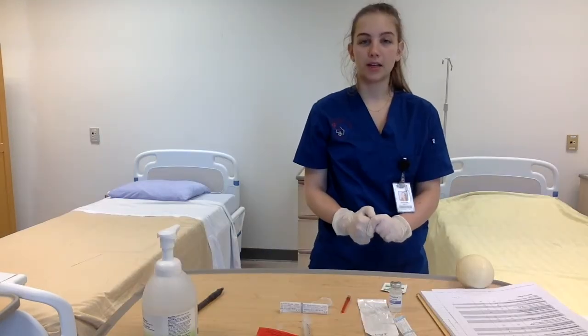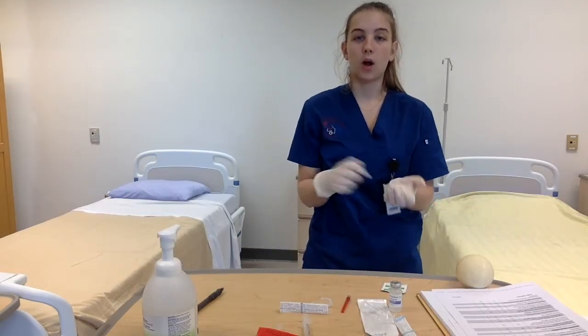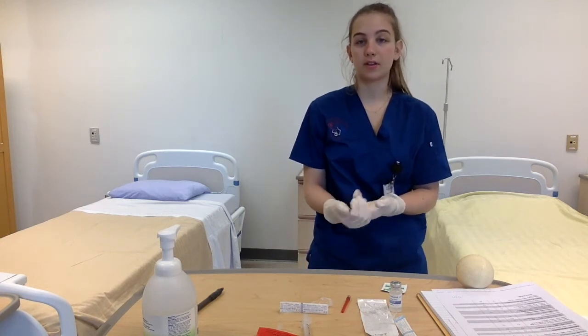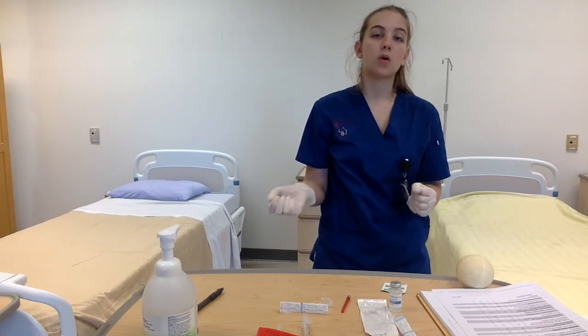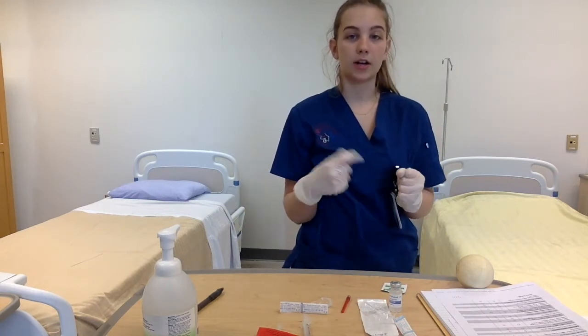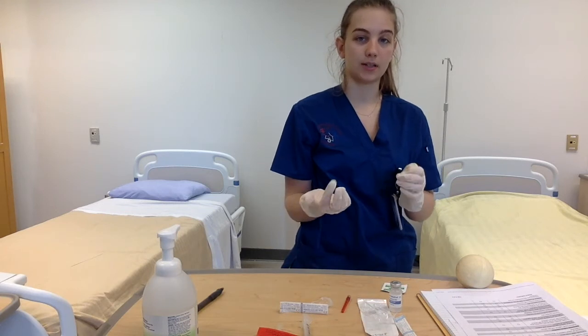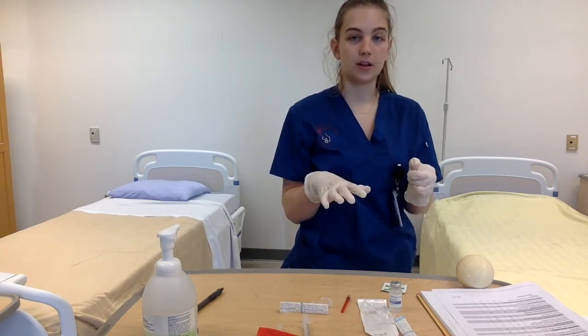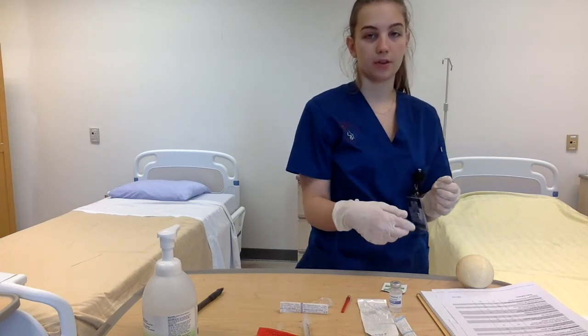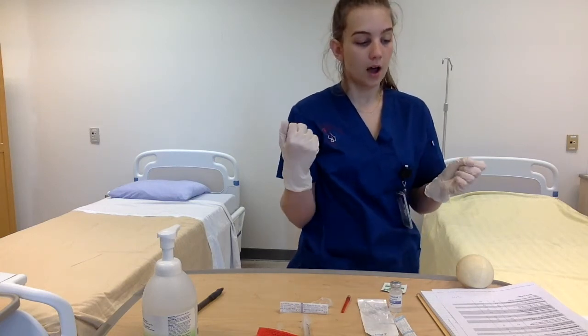We prepared our medications. I have washed my hands and put on some gloves in order to give these injections. So first we're going to be giving the subcutaneous injection. So on my patient, I need to make sure that I check their bracelet and another identifier. So I'm just going to ask Mr. Mancini to repeat his name and birth year back to me as his identifiers, and I'll compare it with the MAR to make sure they match up.